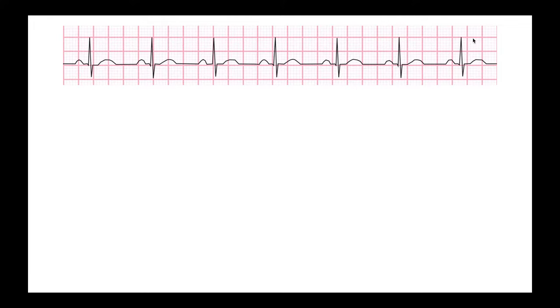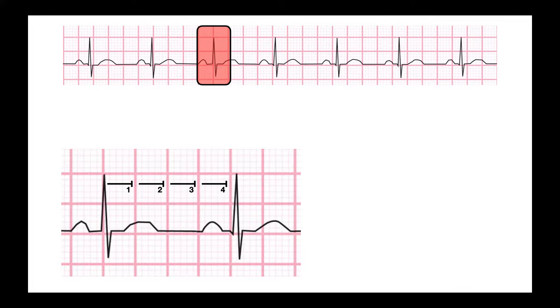So the first step is to figure out which peak is the best to look at. It looks like I have seven to choose from, but I'm going to pick this one right here. If you can, the best peak to use is one that is right on one of these solid lines.